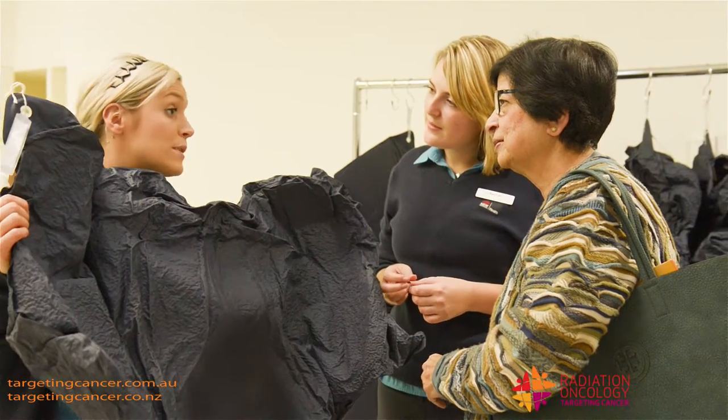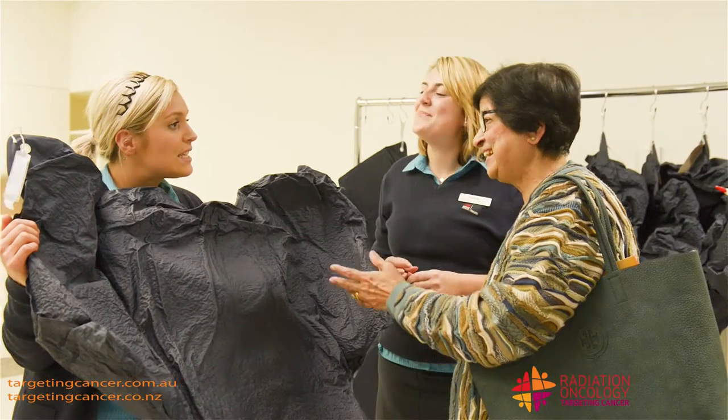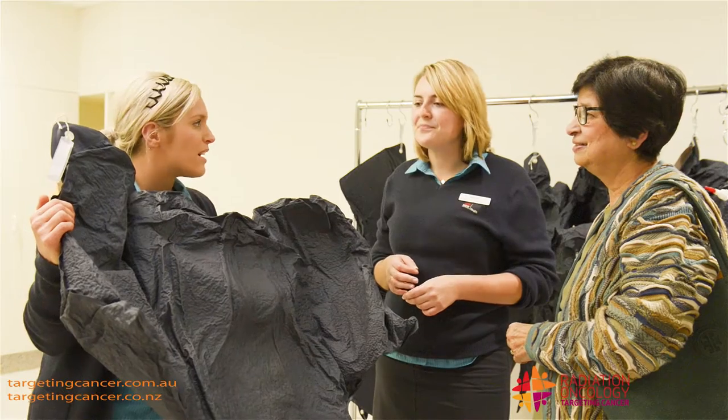It's like when I got one made on me — because we do it for practice on each other. You know when you're at the beach and you dig yourself into the sand? That's exactly what it feels like. It kind of supports you and it's firm but it's not uncomfortable.